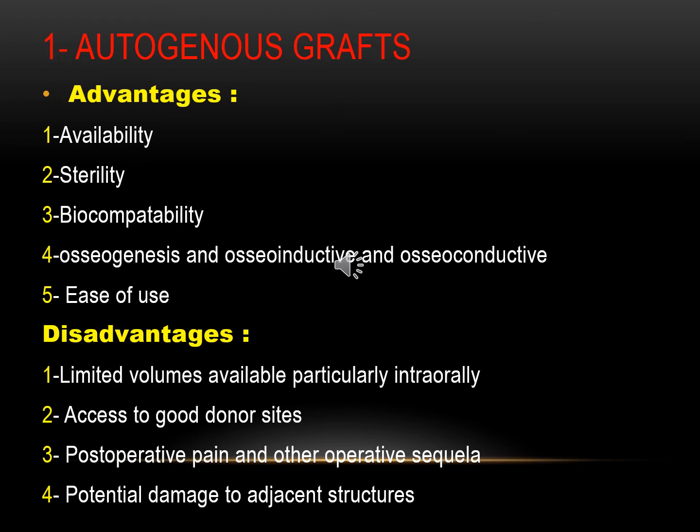Usually we make the harvesting of the bone graft and the grafting procedure at the same time, in the same operation room and under the same sterile circumstances.